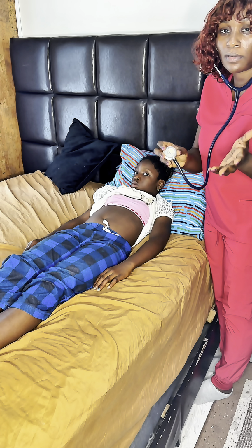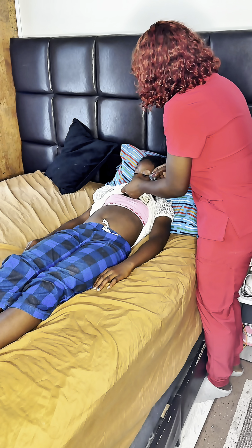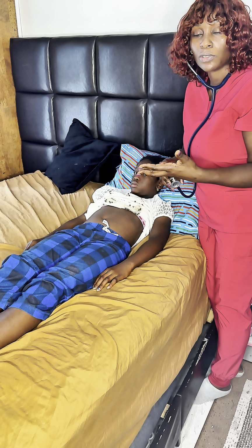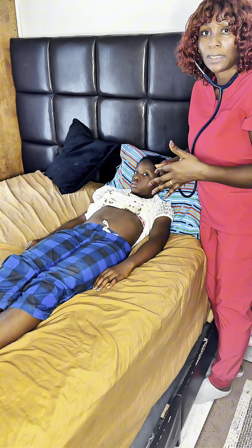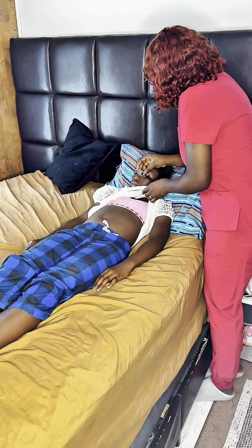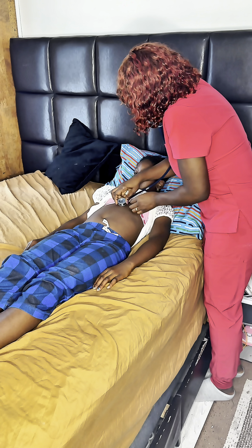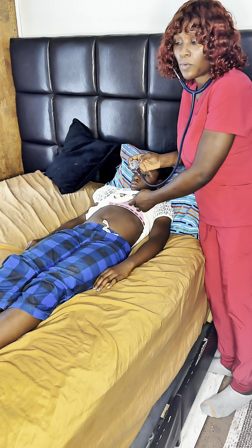Now I'm using my bell. I'm going to be listening for S3 and S4, and I'm going to go just the way I went before. I'm going to listen to the aortic, the pulmonic, Erb's point, the tricuspid and the mitral. There is no S3 and S4 present.